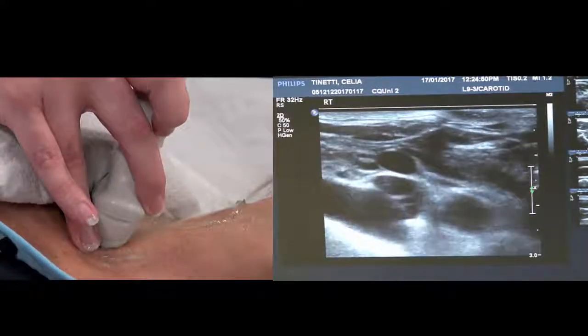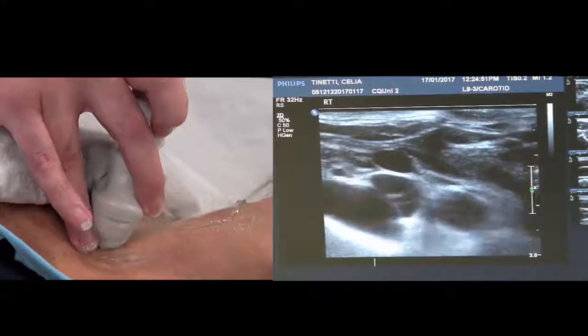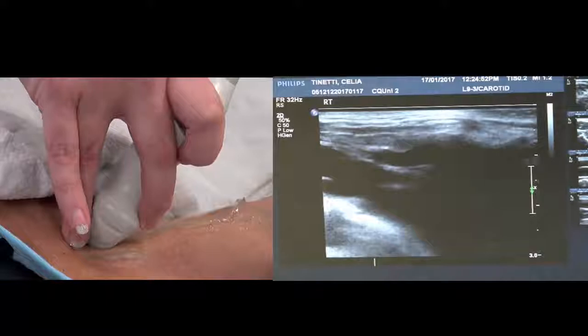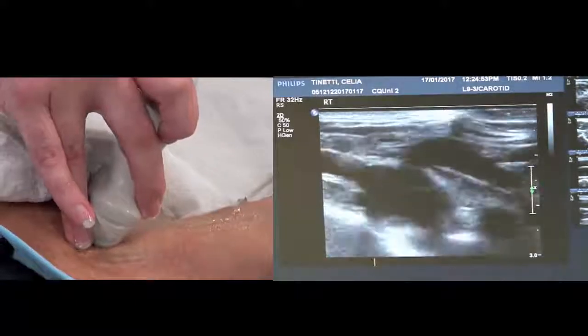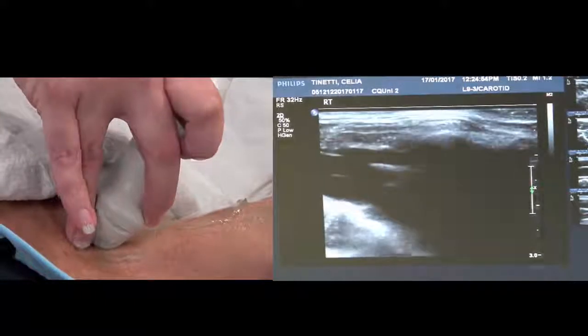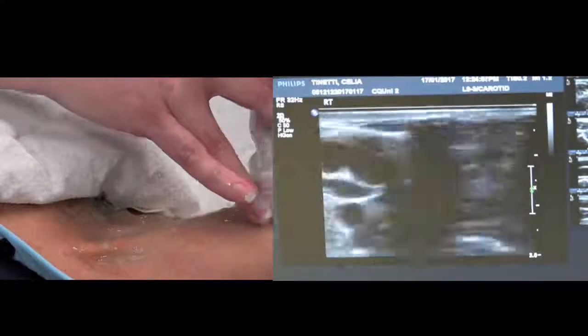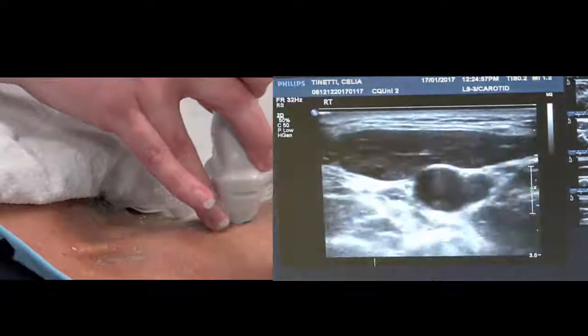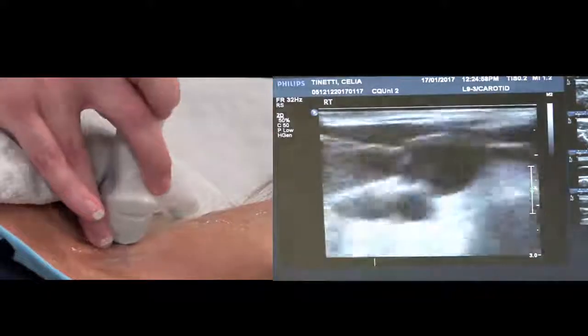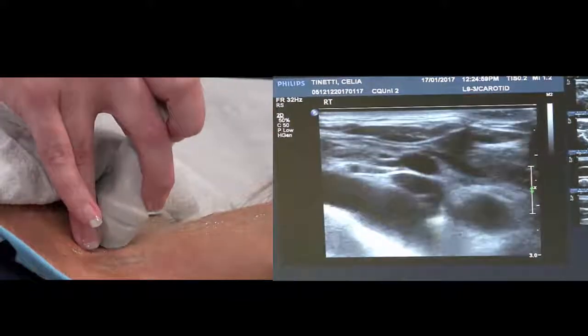The reason for starting with the subclavian is it just gets it done. You've started down here, you move all the way up, go to vertebral and you're done for the patient. It will save going back down again.